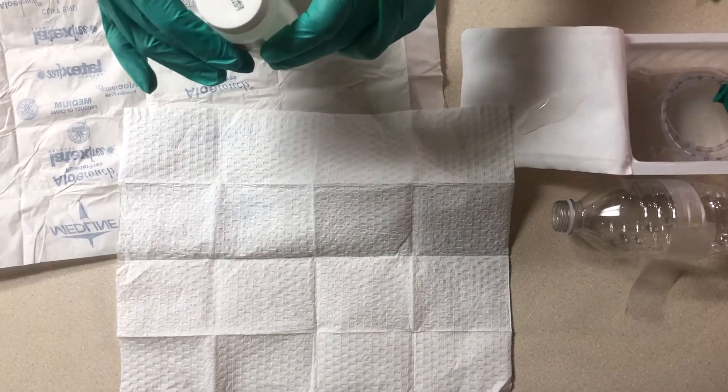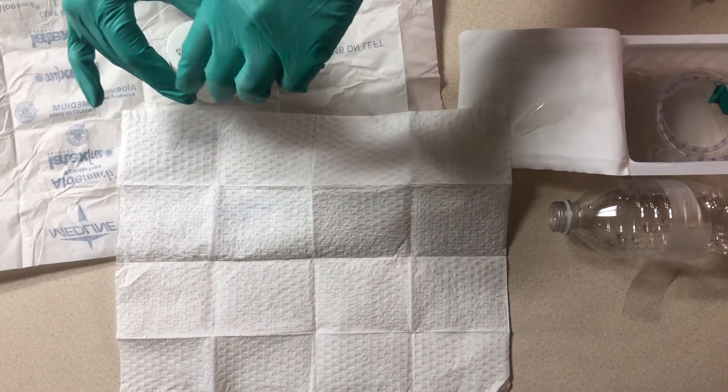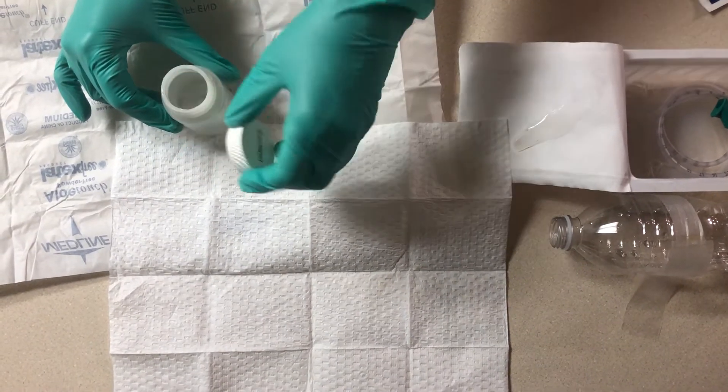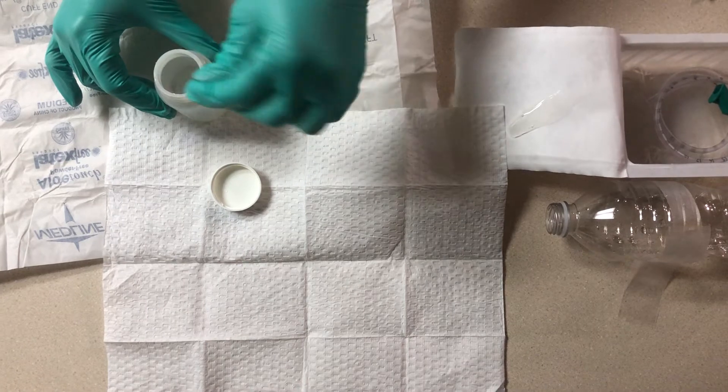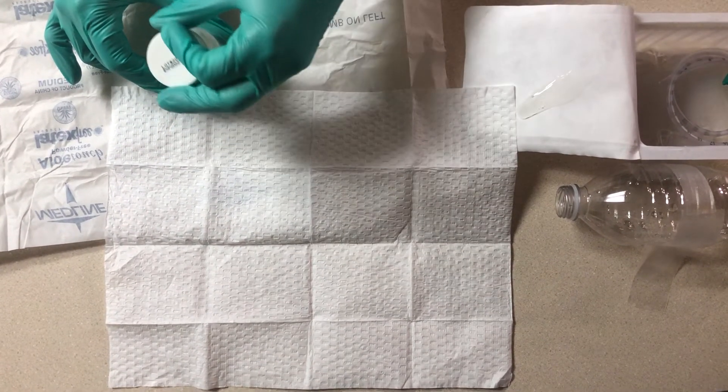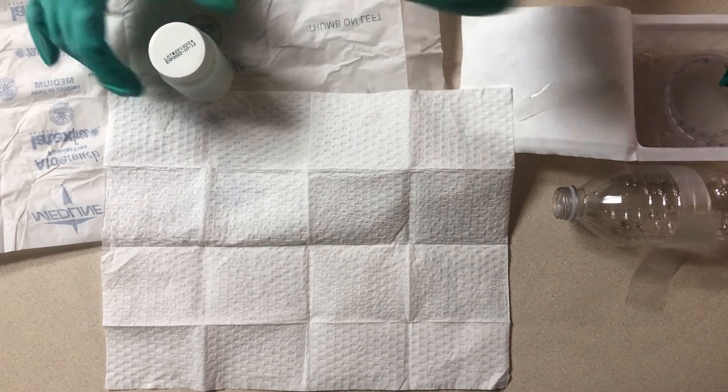Your sterile water is used to clean the suction catheter in between passes. Take the lid off — you're going to have to peel off the inner seal, and then just gently sit the lid right back on.